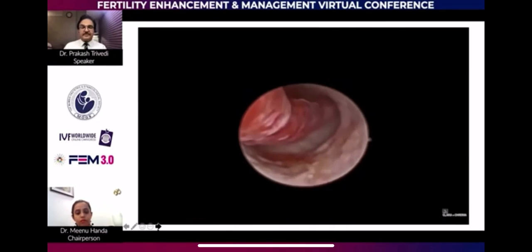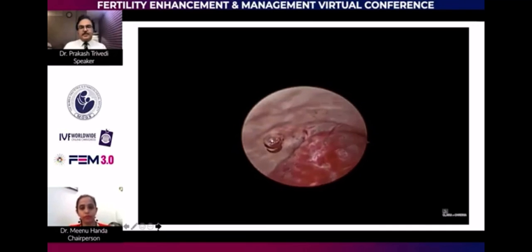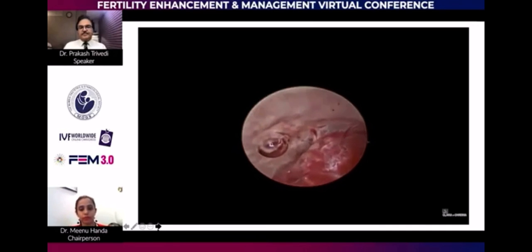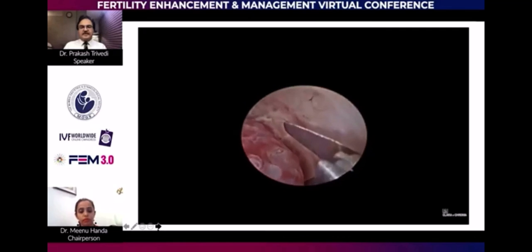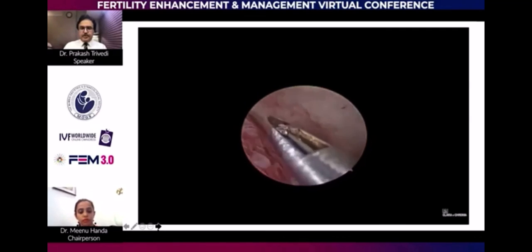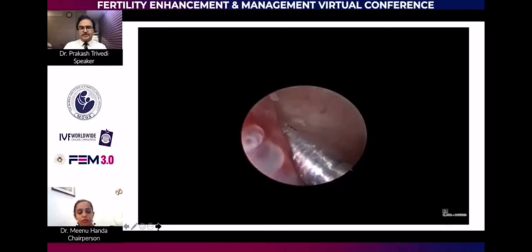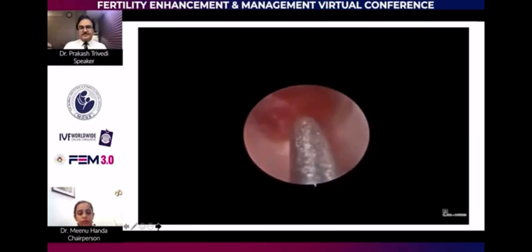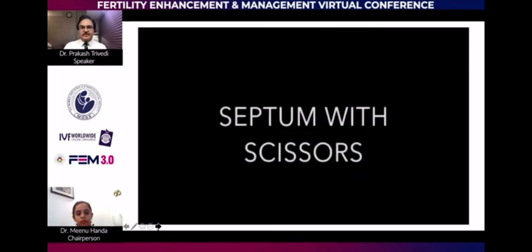If you want to evaluate a cavity — here is a polyp, and you can easily make it out and go around to cut it. There are important protocols of polypectomy, determining which polyp should be removed. In relation to ICSI, if there is a polyp, you can catch it with the polyp grasper and remove it.